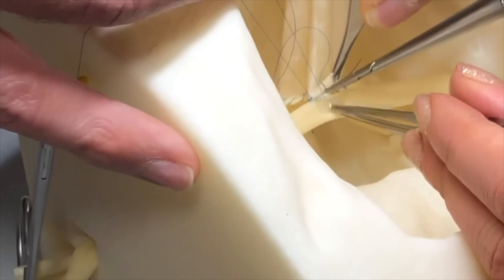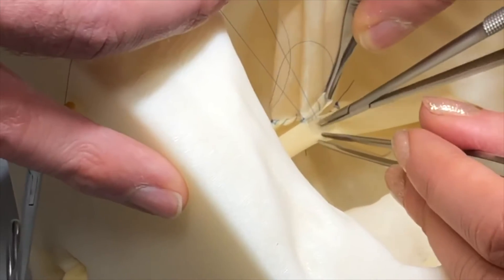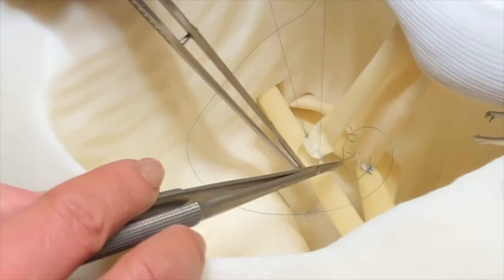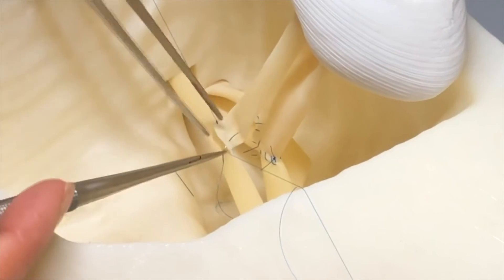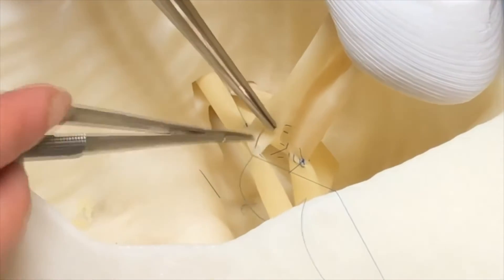On the straightaways, if comfortable, I go through both layers in one bite. But when I round the corner, I return to taking the bites in two to ensure the angles of the corner are correct, as you can see here.